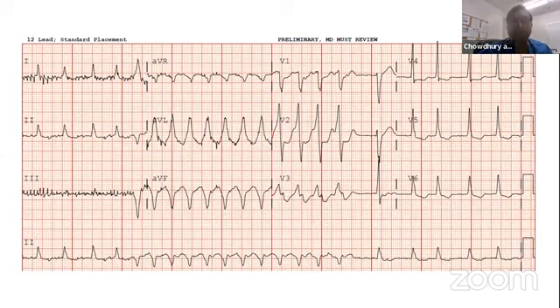Also, I wanted to request that you please check the RR interval and do as much as you can. Try to understand the mechanism of ventricular depolarization and the mechanism of atrial depolarization. If you don't see any atria, at least try to figure out what is happening with the QRS complexes, the RR interval, and change of axis. These are simple things. Don't let anyone intimidate you because of the EKG. Do as best as you can, know things better. And when you know better, then you do better.